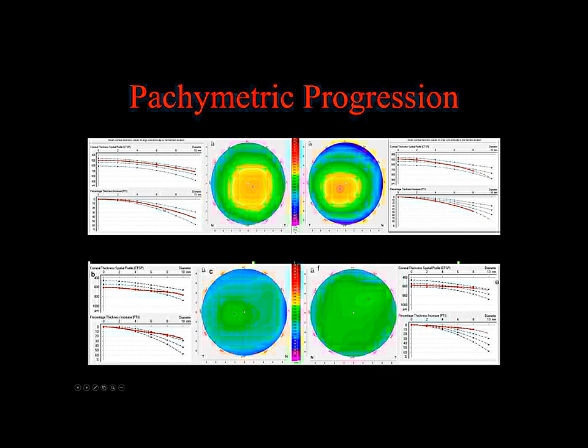And I'm just going to concentrate on the lower graph here because it's easiest to understand, really the only one that I routinely look at. That's called a percentage thickness increase. And there were three lines, upper, lower, and middle. You can't see, let's go over here because this one's being hidden by the red. So this is a 95% confidence interval of a normal eye. This is the mean. So it's mean and 95% confidence interval. This represents the rate of change.